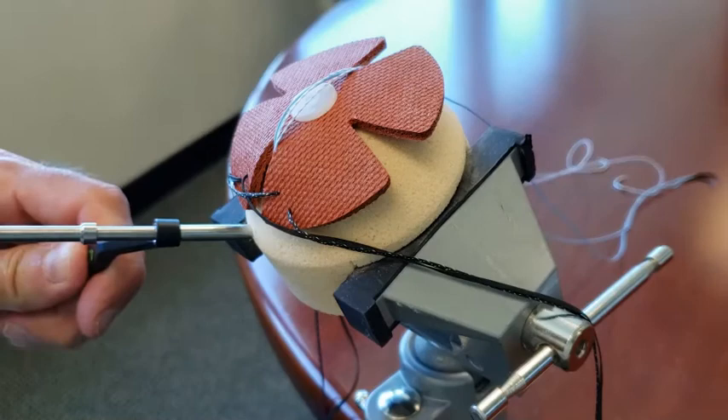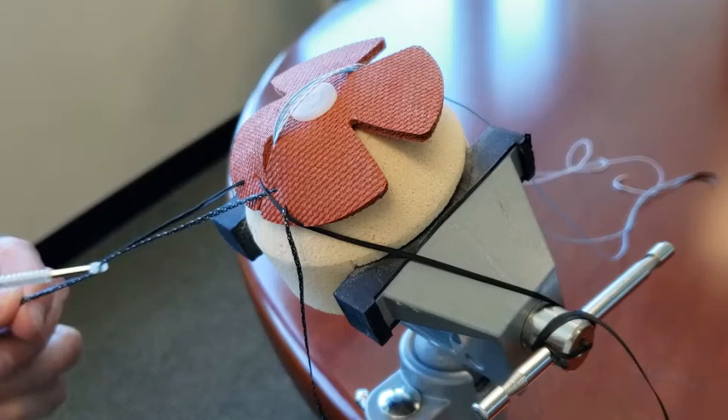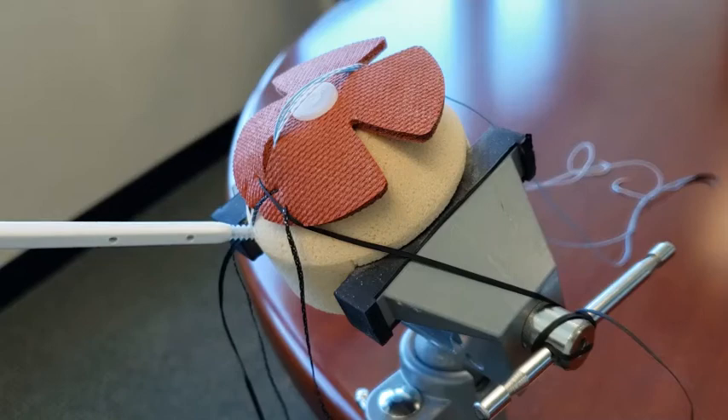Next you're going to grab the free limbs where you cut the needles and put them through the snaring mechanism. Pull the tab while holding the limbs and usher them through the eyelet. Make sure the suture is freely moving within the eyelet, then insert the anchor by malleting and ensuring the distal threads are engaged into the bone. Turn the knob until the white tip of the inserter reaches the bone, then remove the pull tab.